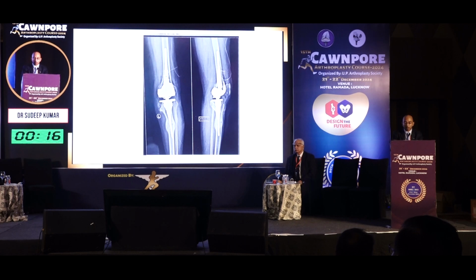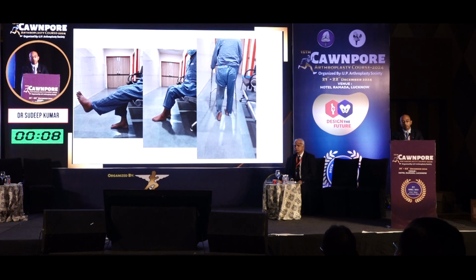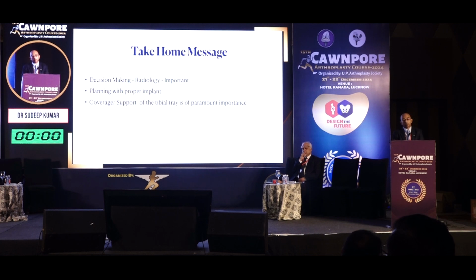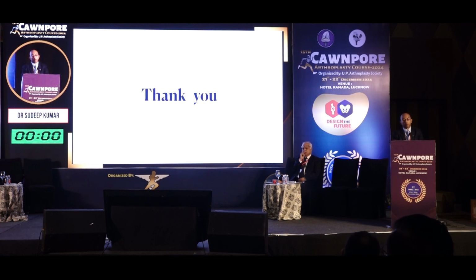Of course, you can see that part of the tray is uncovered, but it is very much centralized and the defect is also bypassed. So this is just 1 week follow-up. So decision making, radiology becomes very important. Plan with the proper implant; cover with support of the tibial trays is of paramount importance. Thank you very much.